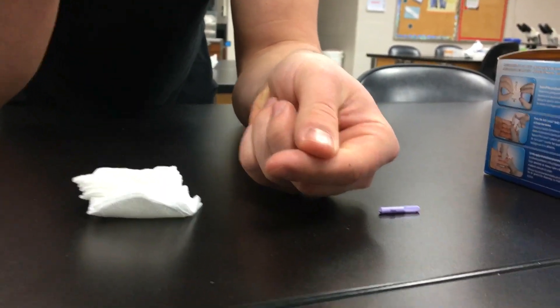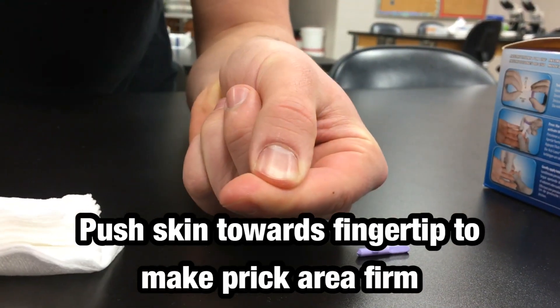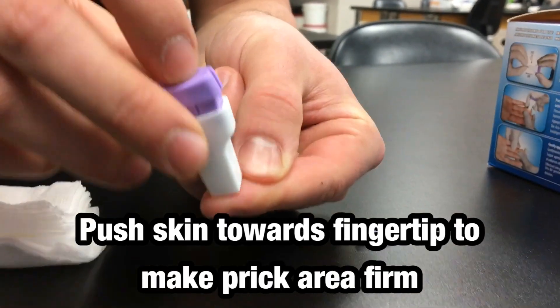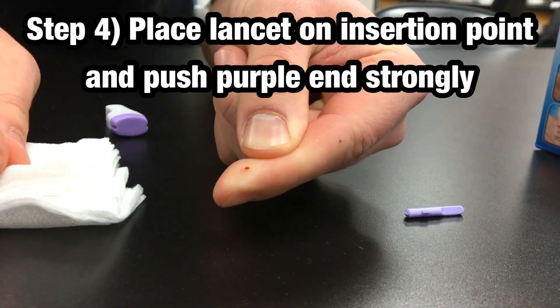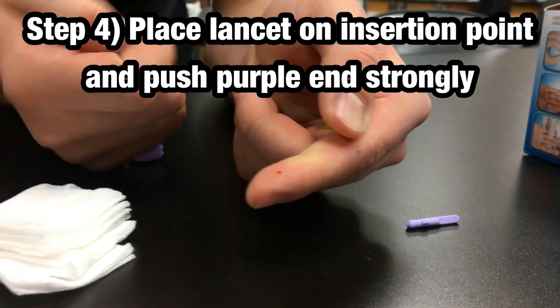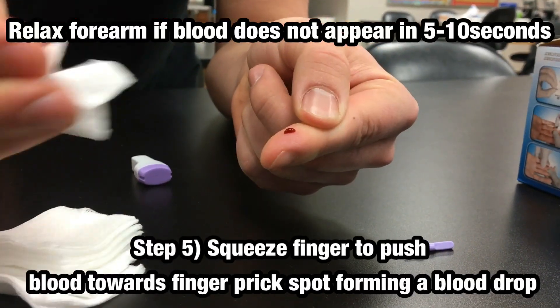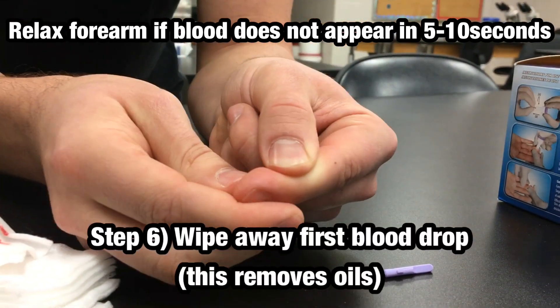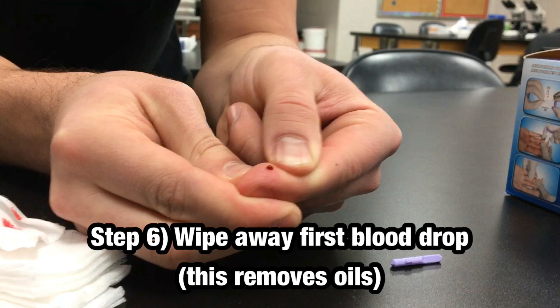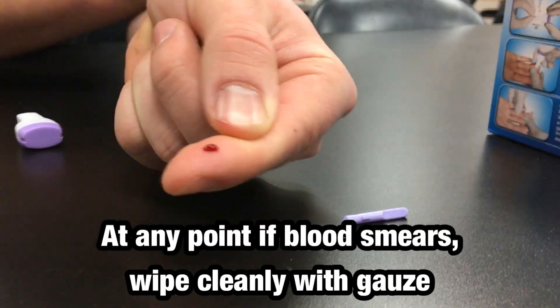To make it a little bit easier on yourself, take your thumb and push up the skin so it's a little bit more firm. Take the lancet, put it on that location on the finger, go ahead and push, and we'll get some blood. Squeeze the finger, almost like you're popping a pimple. Once you get some blood, wipe off the first sample of blood, and then get another sample. Now if you're taking a measurement for glucose or whatever it may be, you're ready to take your blood sample.